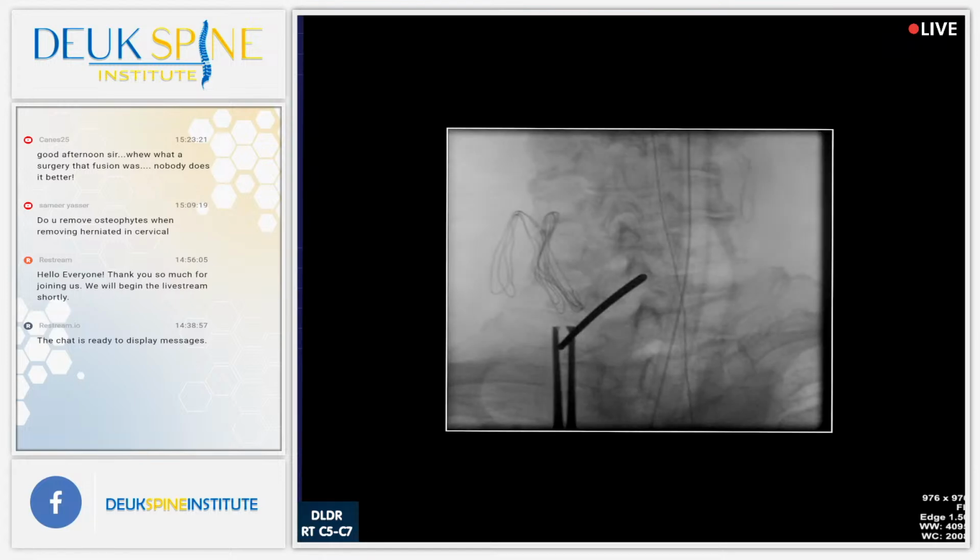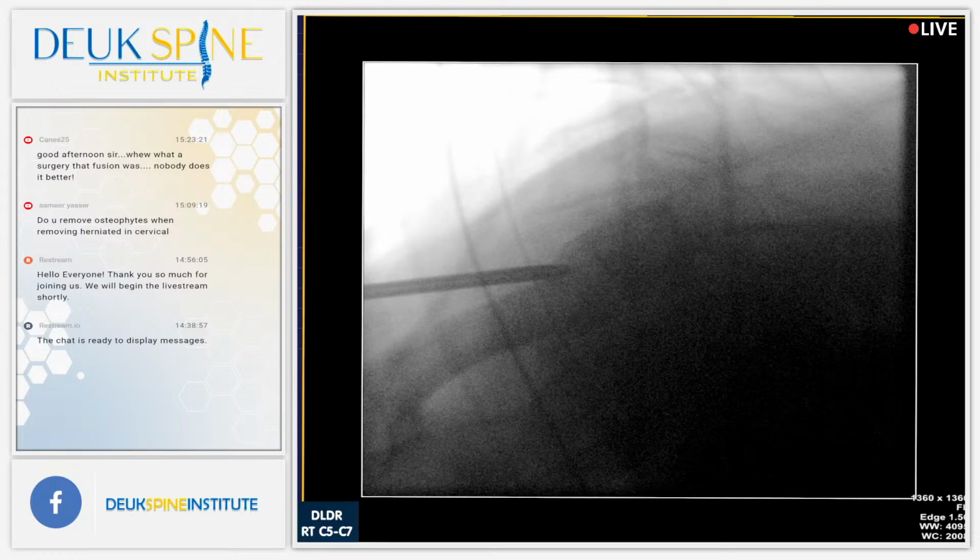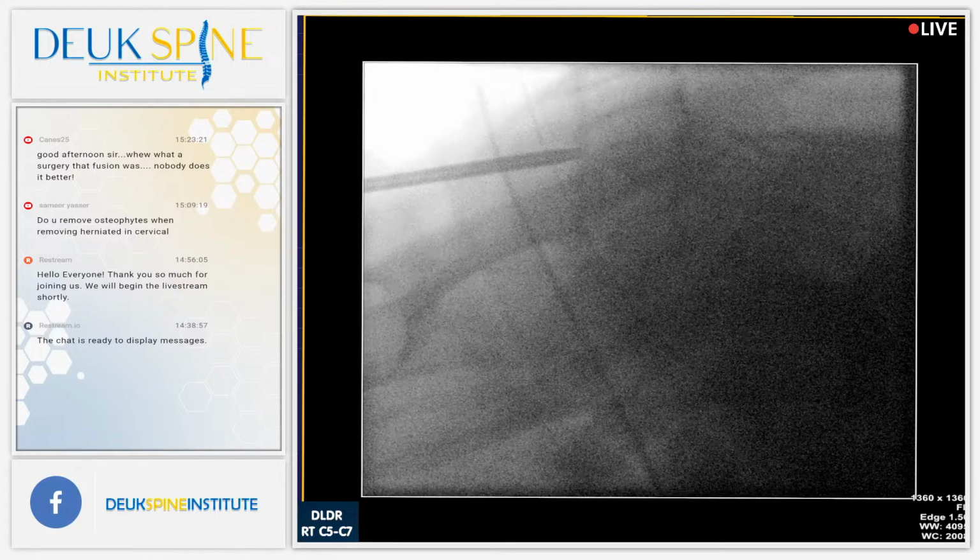Perfect, let's go back to a lateral. Same lateral view you gave me last time. So I'm right in the middle. That's it right there? Yes, sir. All right, can you clean up that disc? Just give me your best disc. There we go. I think that's better, right? Yeah? I like it. Let's try this.